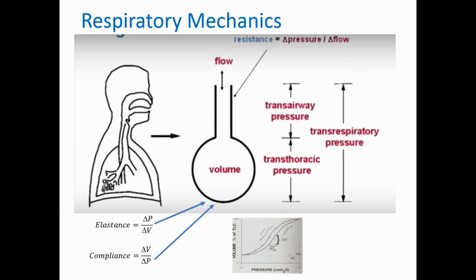That's the difference between them. In positive pressure breathing, the airway pressure is positive, and the atmospheric pressure is normalized at 0. So that's how air will flow in. In negative pressure ventilation, the airway pressure is still lower in comparison to the atmosphere, and that's why air will flow in by being pulled through.